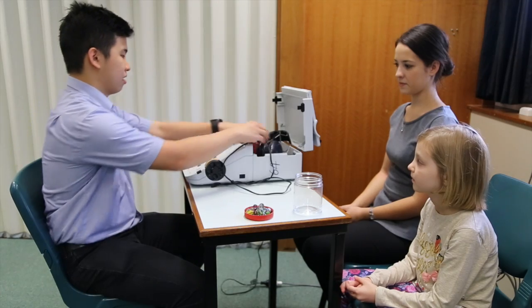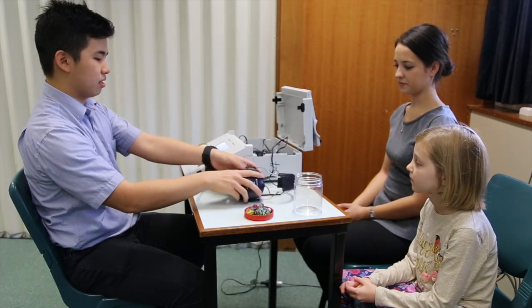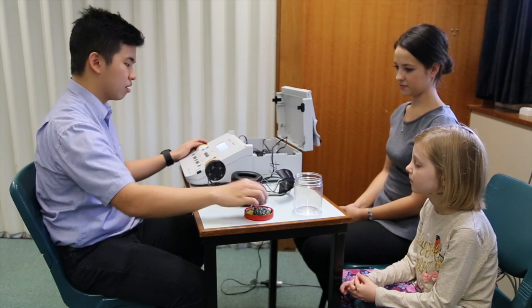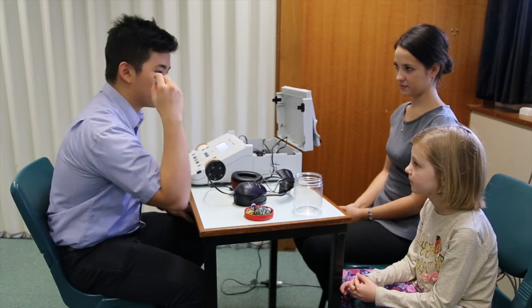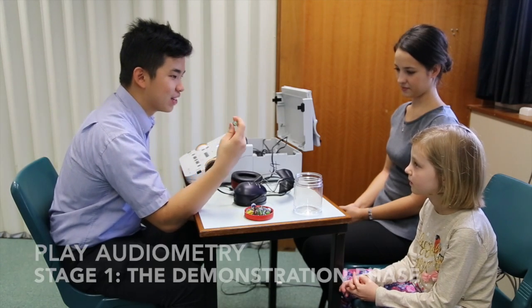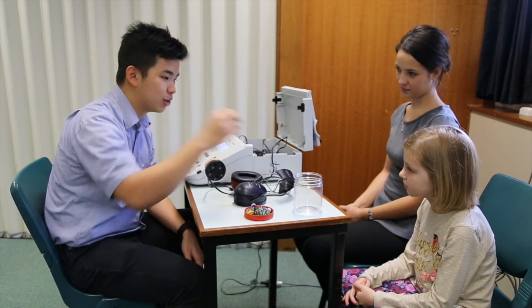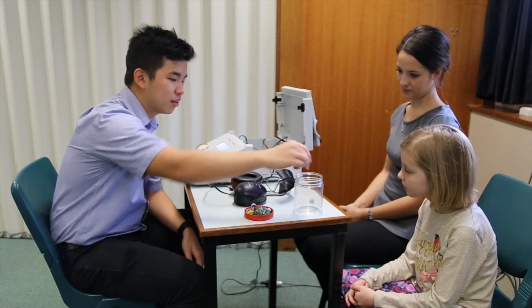The type of assessment you carry out for a screening should be age appropriate. Play audiometry is suitable for children over 2.5 years, whereas pure tone audiometry tends to be suitable for clients 5 years and over. The difference between pure tone audiometry and play audiometry is that the response for the latter is a play response.